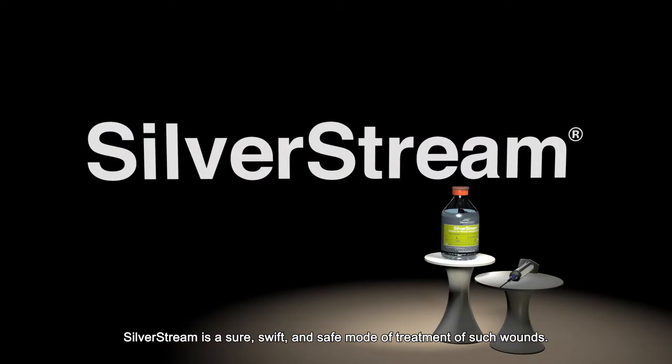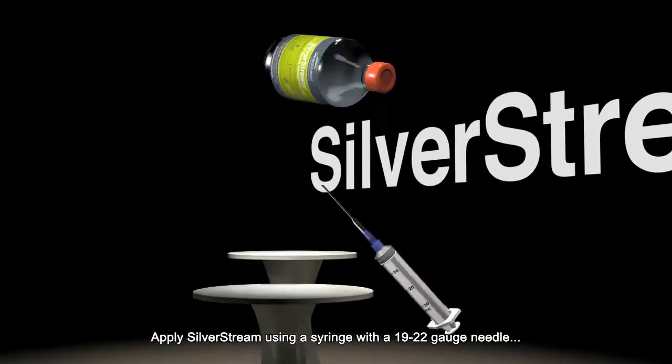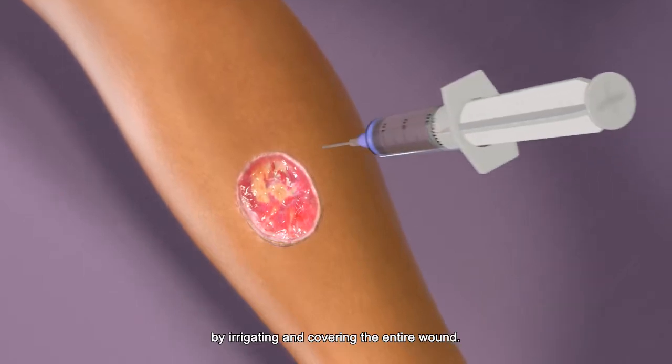Silverstream is a sure, swift and safe mode of treatment of such wounds. Apply Silverstream using a syringe with a 19-22 gauge needle by irrigating and covering the entire wound.